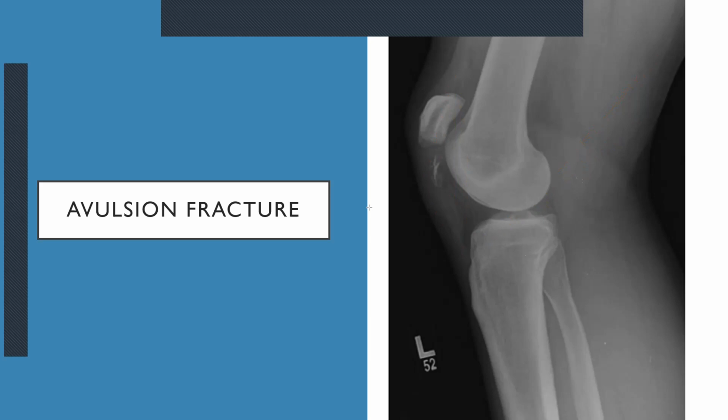It can occur sometimes with longitudinal force, but it's not really that common, I must be honest. I've never really seen it like that. So you may see a piece of bone that's split off, and sometimes the avulsion can occur at other places. Of course, you can get an avulsion on the tibial tuberosity. It's not very common to get it on the femur, as that's not generally one of the weak points associated with the patellar tendon, but rather as it crosses over the patella and then as it joins up to the tibia as well. So these are the more common areas in which you'd find an avulsion fracture.